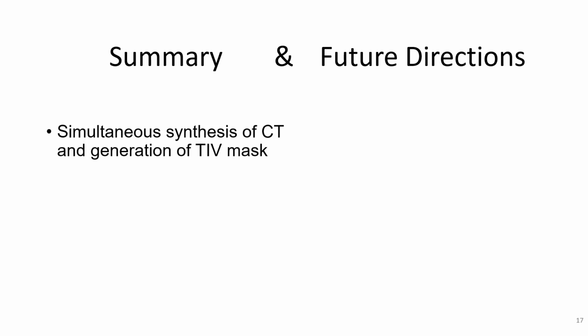To summarize, through this study, we propose a way to estimate the total intracranial volume mask while synthesizing a CT from multimodal MR images. The architectural design of the CNN-based model allowed us to extend the well-established Pix-to-Pix network to generate two outputs simultaneously rather than using a series of cascaded networks to do so. This reduces the number of training parameters and also provides a better feature encoding.